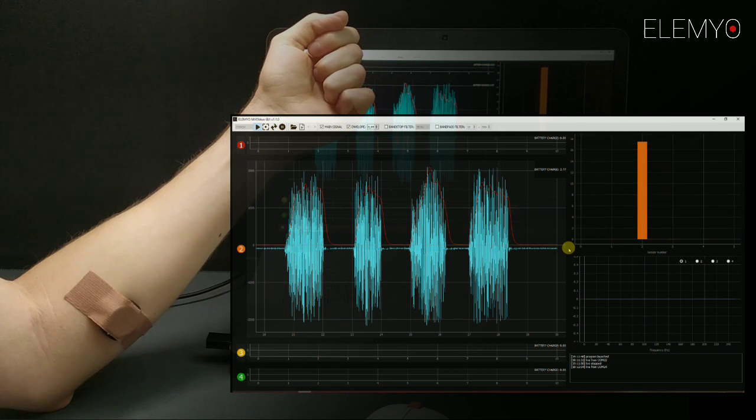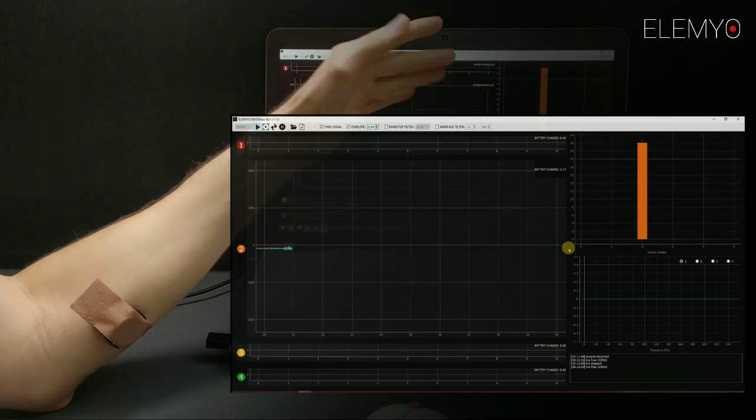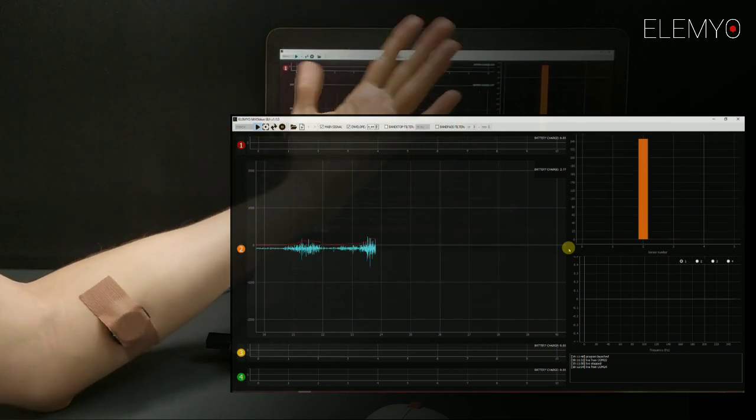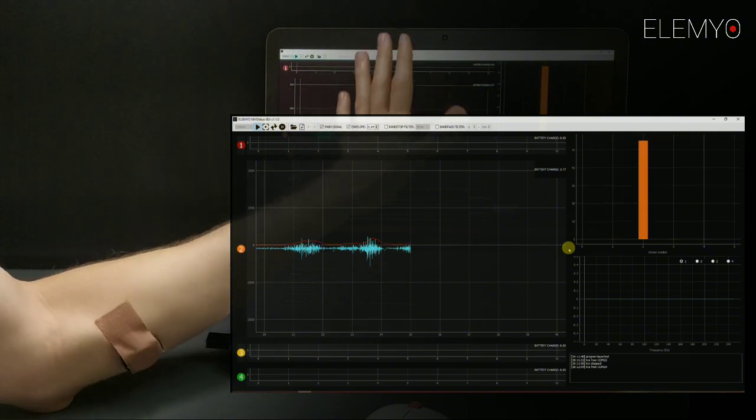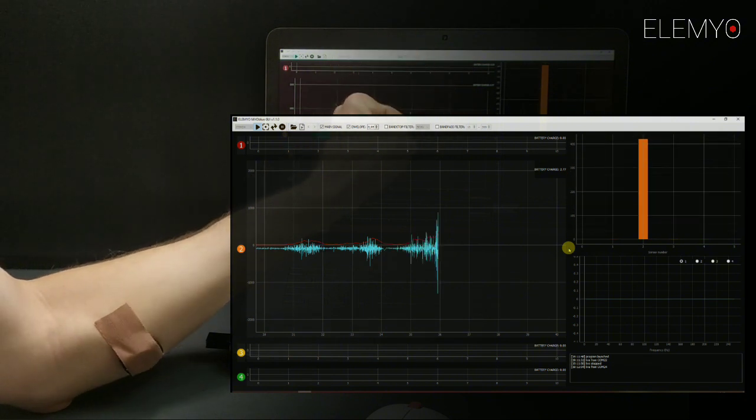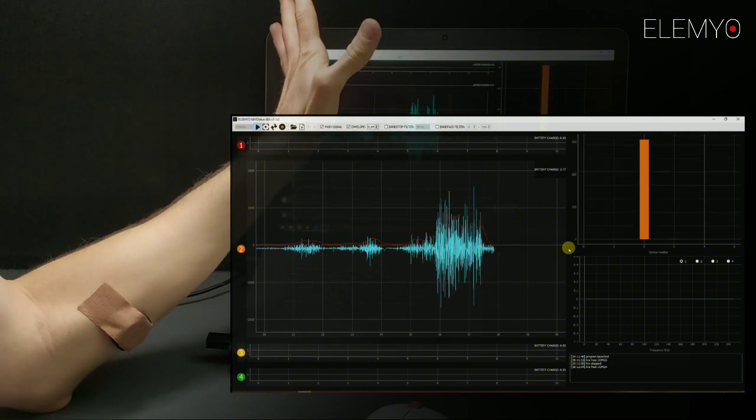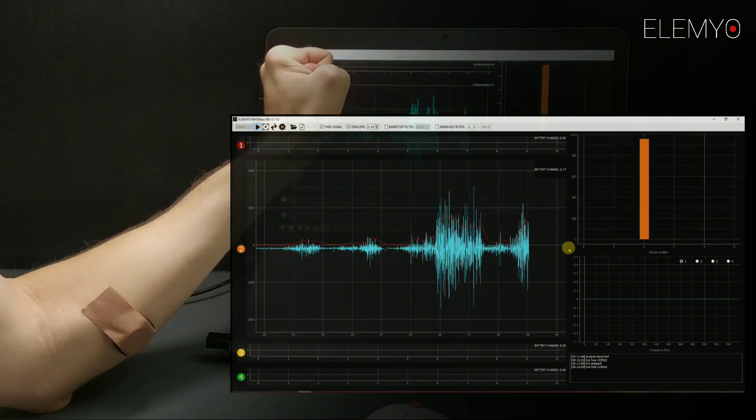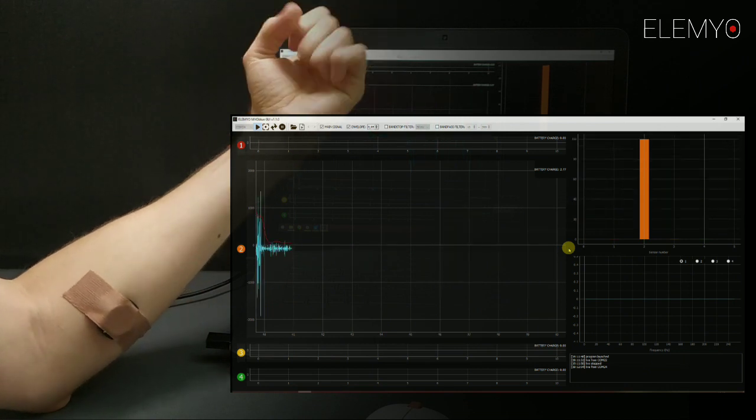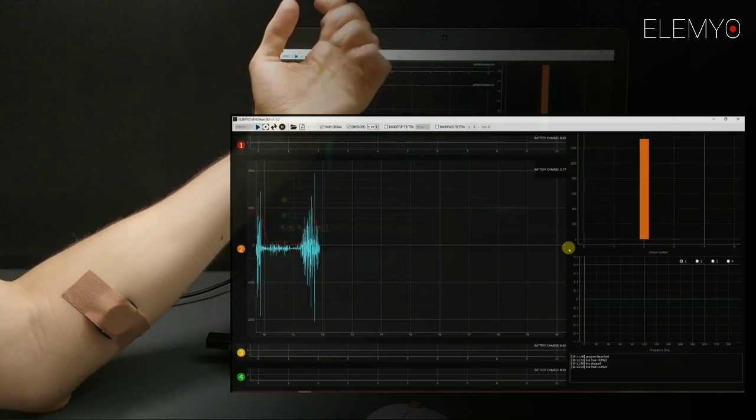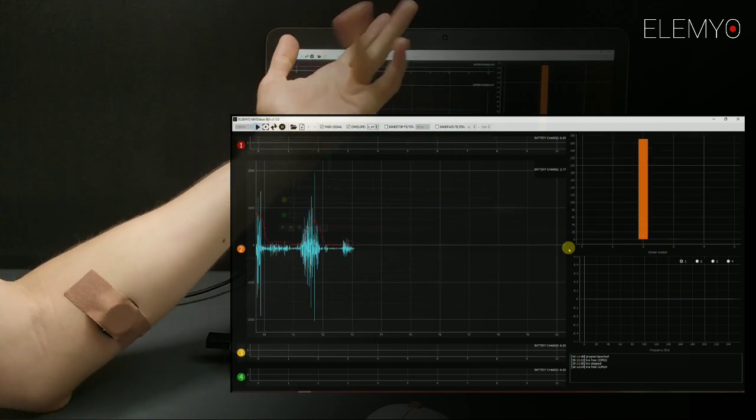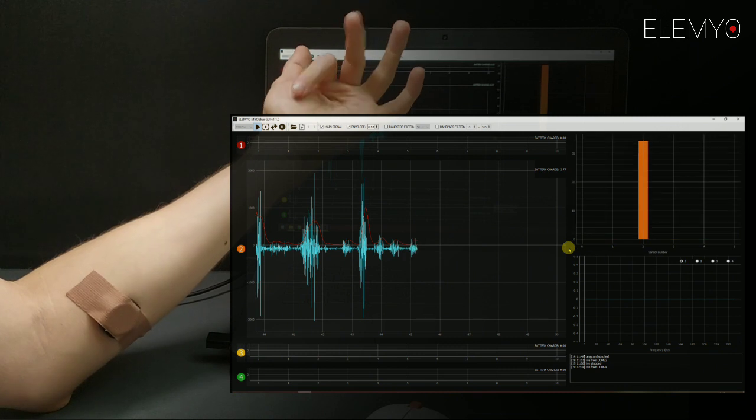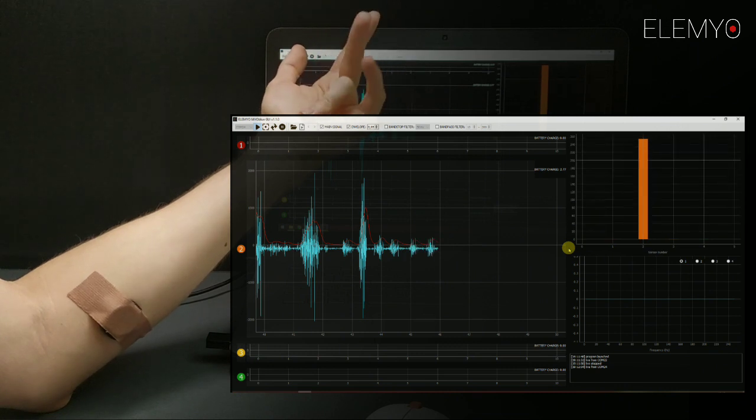You can see that muscle contractions varying in strength and duration could be easily visually detected on the graph. You can see that the Myoblue V1.1 sensor registers various muscle activity, even finger movements.